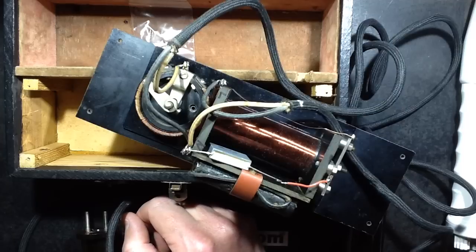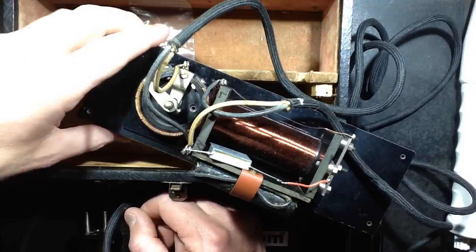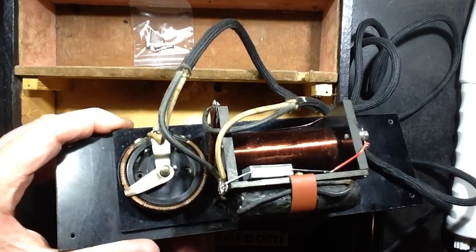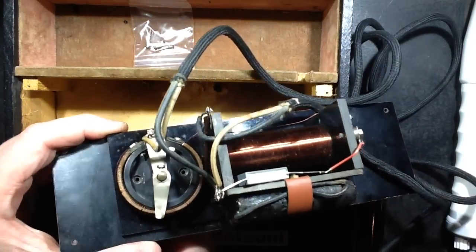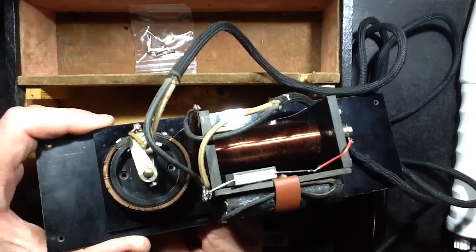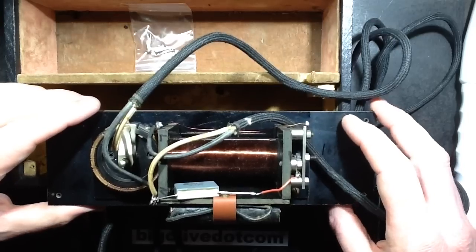Now let's see, what's the name? I've just suddenly forgotten the name. Why would I have forgotten the name of a variable transformer? Variac. I was thinking variac and thinking, no, that sounds wrong. But it's not an actual variac as such, it's a variable choke. And it just varies the power from off up to full power.